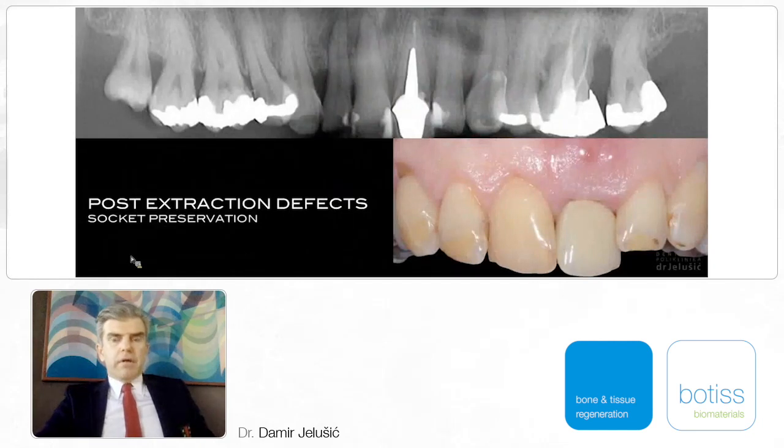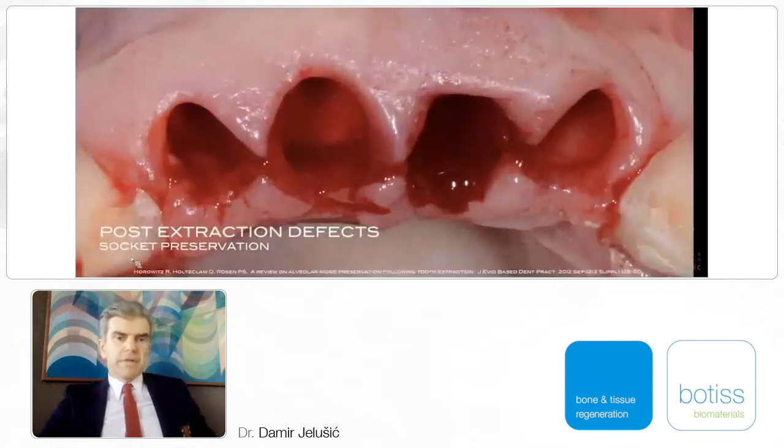From single tooth replacement, I skip to bridges in the front. Here is a situation with 4 incisors. You can see fistula, granuloma. We did some attempt at endo, but without any success, the fistula persisted. So at the end, I decided to solve the case with implants.